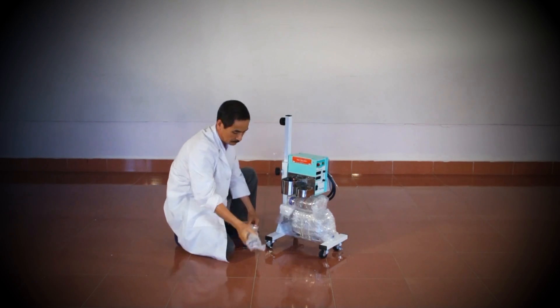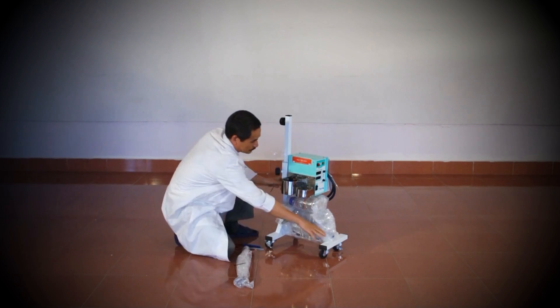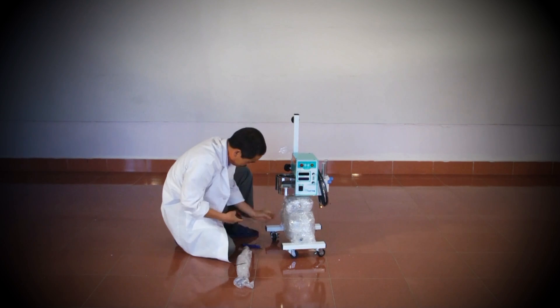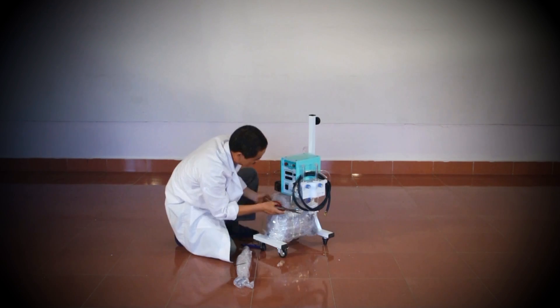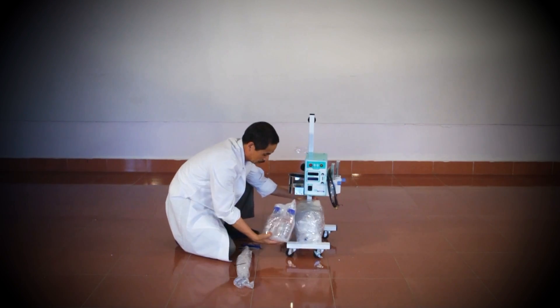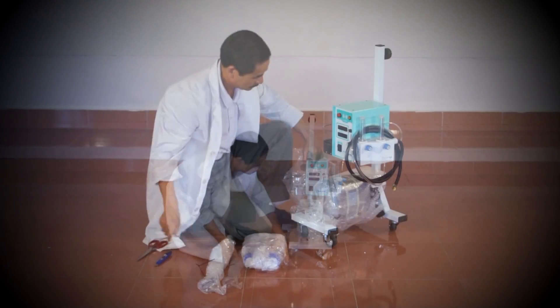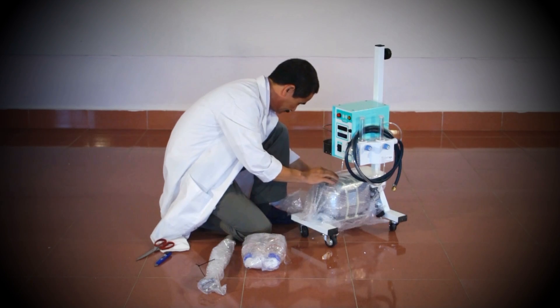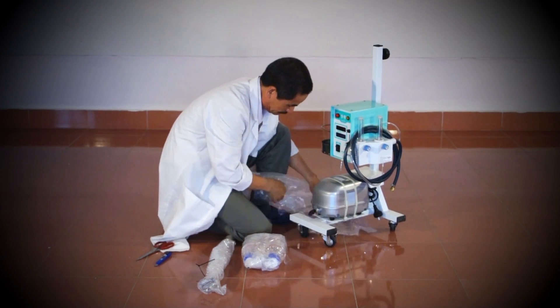Begin by unpacking the components attached to the CPAP main unit and place them to one side. You can remove the bubble wrap later. Now remove all the straps and clamps holding the wires and tubes, as well as the bubble wrap protecting the air compressor.